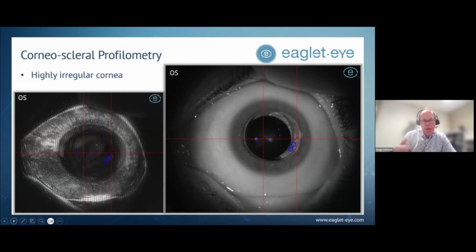And you see the maps to the left; this is the first thing I look at. Obviously, the software will provide you with some indices of quality of the image, the focus, all that stuff. But I don't really rely on that. It's useful to have as information, but I really look at the maps, and I really look at the image. Am I satisfied with the quality of the image that I have?